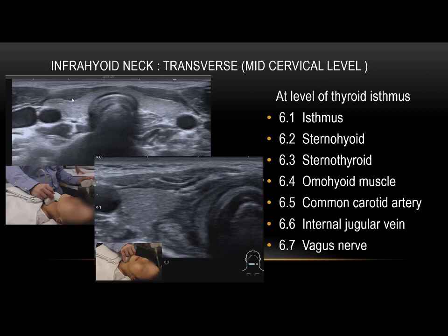There's a group of small muscles that cover the thyroid anteriorly like this. When we zoom in on this strap muscle, we have several groups of muscles. But the main thing that you have to remember is there are three muscles, including sternohyoid, sternothyroid, and omohyoid muscles, which we'll demonstrate here. So which one is which?